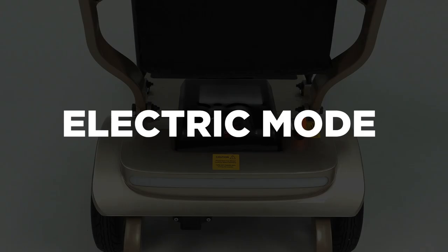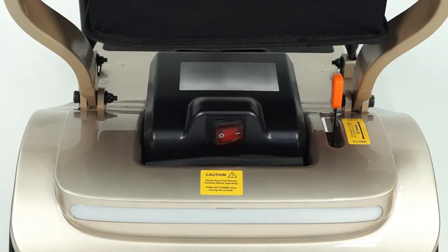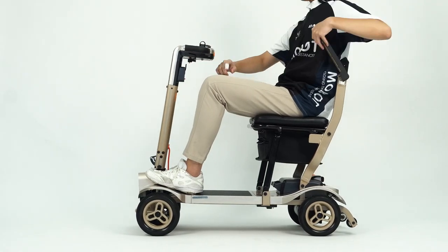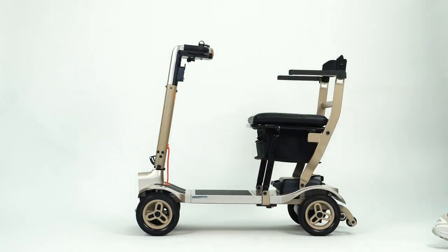Electric mode. Before you turn on the scooter, make sure the orange clutch is pulled down, enabling electric mode. Electric mode allows the user to move independently and prevents the scooter from moving when being pushed.